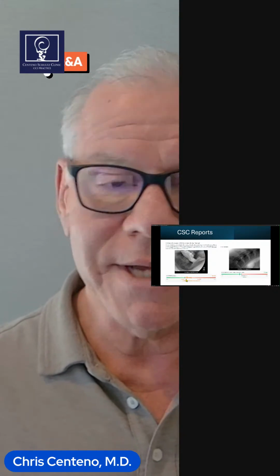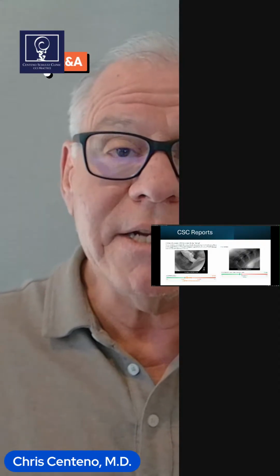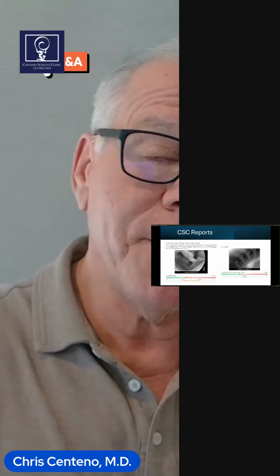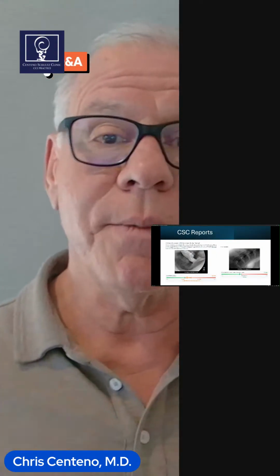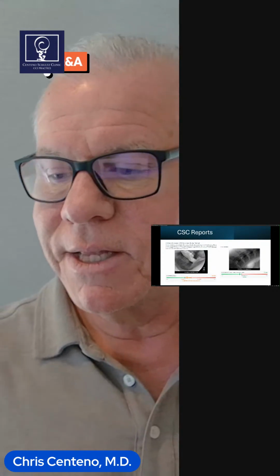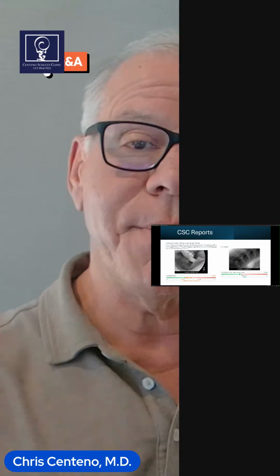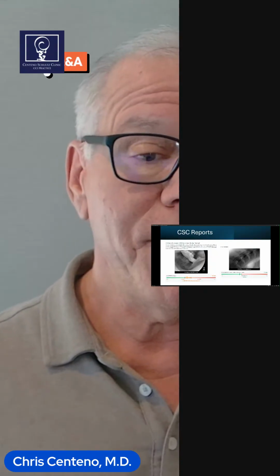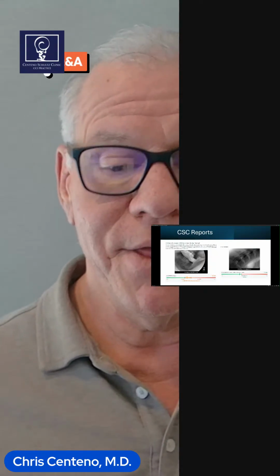Same thing over here. So this one's abnormal, this one's normal. It allows you to quickly see what normal is, what value is abnormal, how close you are to normal, how close you are to abnormal, how far into the world of abnormal you are. Because that's a common question I get all the time from patients. How abnormal is this? Is it a little bit abnormal? Is it a lot abnormal? Is this the most abnormal thing you've ever seen, etc. So this allows me to convey to the patient very simply, in a way that they're used to seeing on their blood reports, how far abnormal or normal they are, or how close to that abnormal line they are.